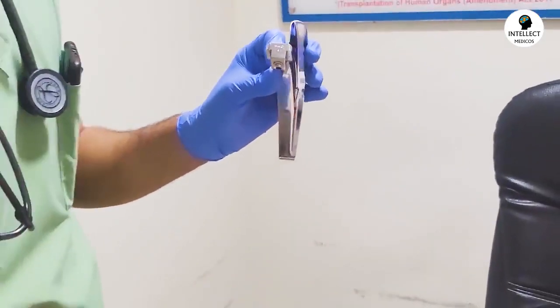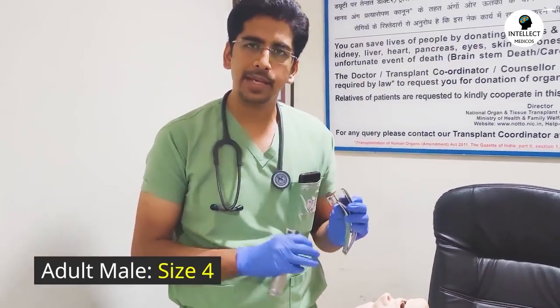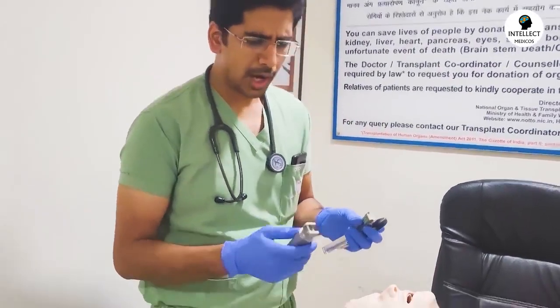In an adult male patient, we prefer to use Macintosh size number 4, whereas in an adult female patient, we prefer to use size number 3. But then again, it depends on the anatomy of the patient. Now, how to use it?